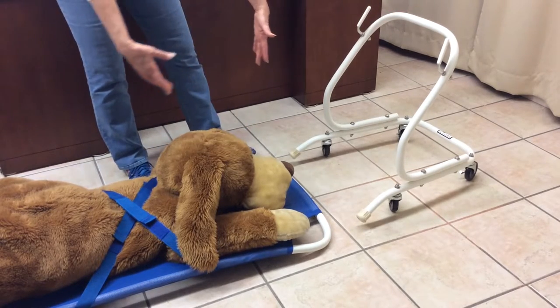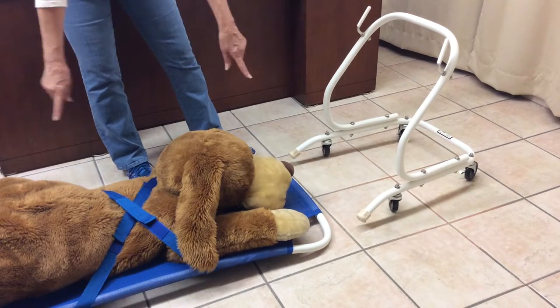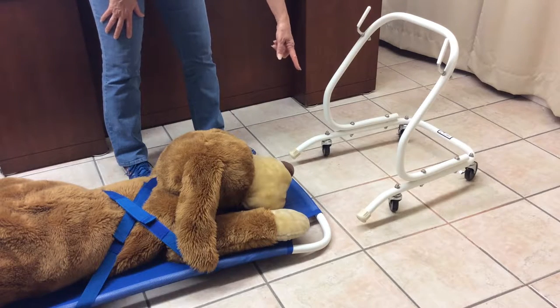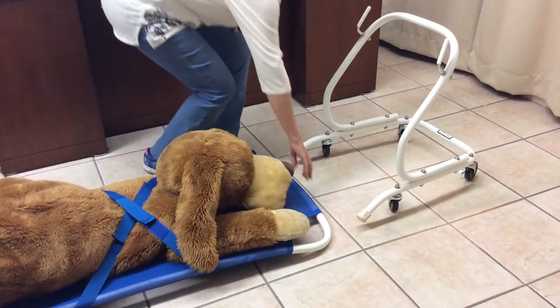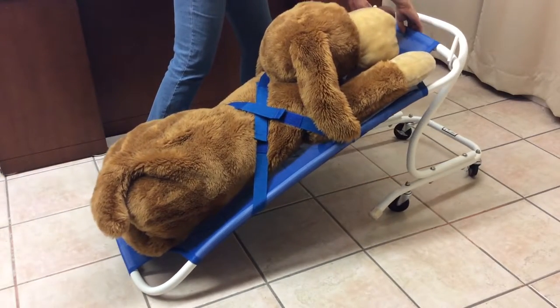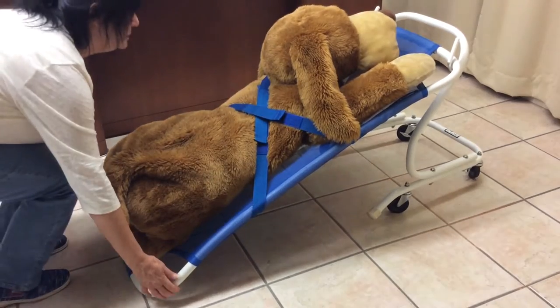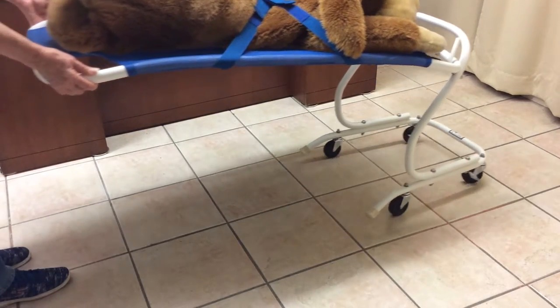Put your patient on the stretcher and be sure to strap him in. Place the handles of one end of the stretcher onto the securing pins of the cart like so. Then pick up the opposite end and wheel the patient away.